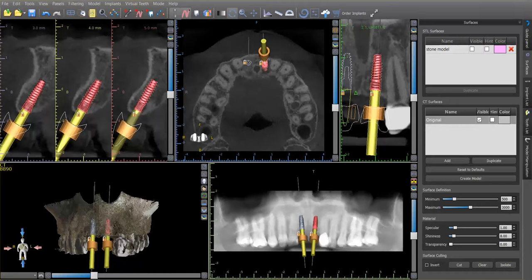Hey, it's Dr. Corey Glenn and I want to show a new feature that has been added into BlueSkyPlan. It's the ability to place an analog hole into the model where you're going to have your implants. This is a really neat development because it allows us to make temporaries or abutments before we even do the surgery and know that they're going to be accurate.